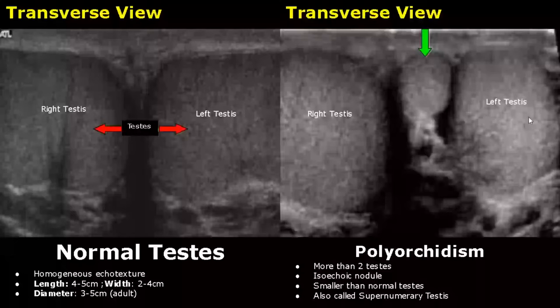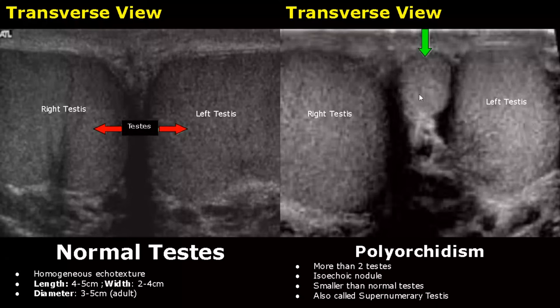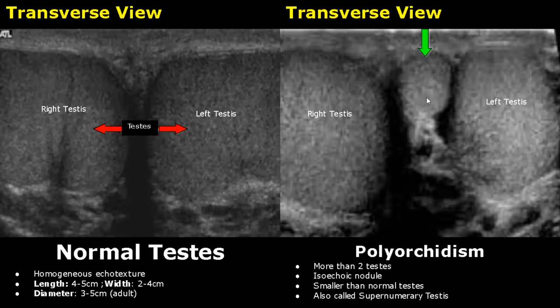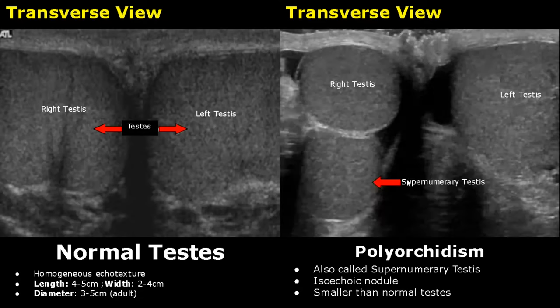In polyorchidism there is an extra testes which is isoechoic to normal testes. It will be smaller in size and is also called a supernumerary testes. Here is another image showing the extra testes behind the right testes.